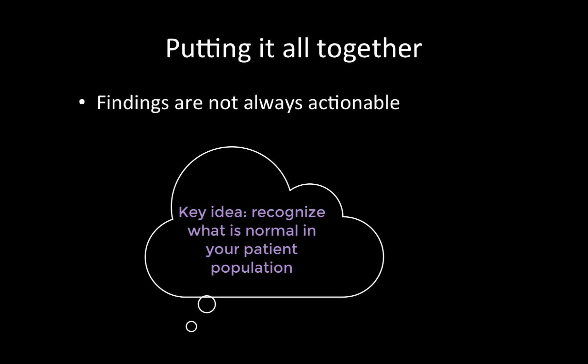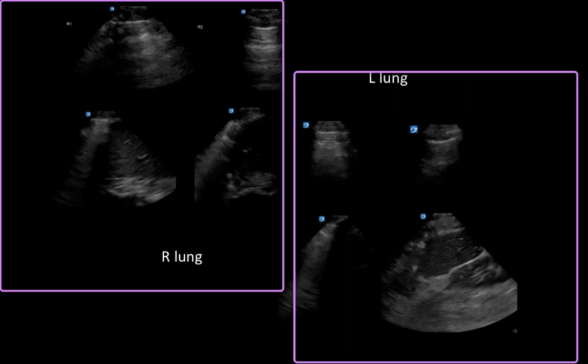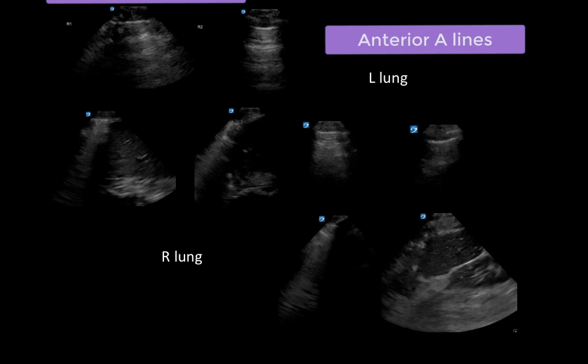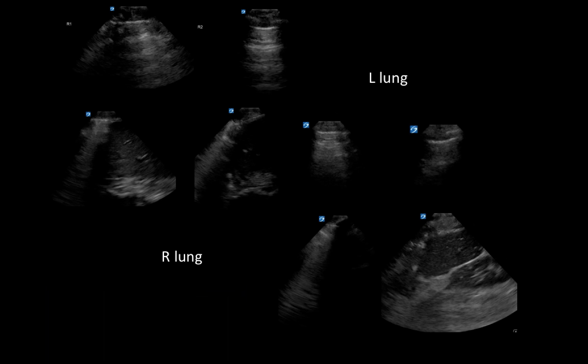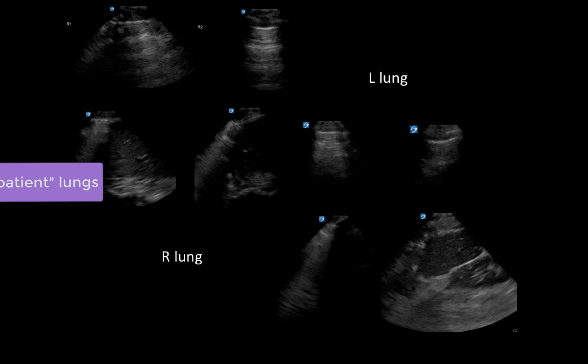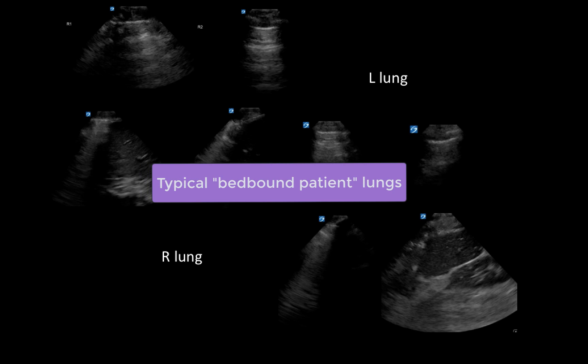Finally, a few points for integrating your findings. It is important to remember that your findings may not always be actionable, and to recognize what findings are normal in your patient population. For example, a lung signature demonstrating A-lines anteriorly with dependent B-lines and small consolidations is extremely common in bed-bound patients, especially those in the ICU, and usually represents a mild amount of dependent atelectasis and edema. In contrast, in an outpatient setting such as a GIM clinic, these findings would be abnormal and would prompt consideration of further workup.